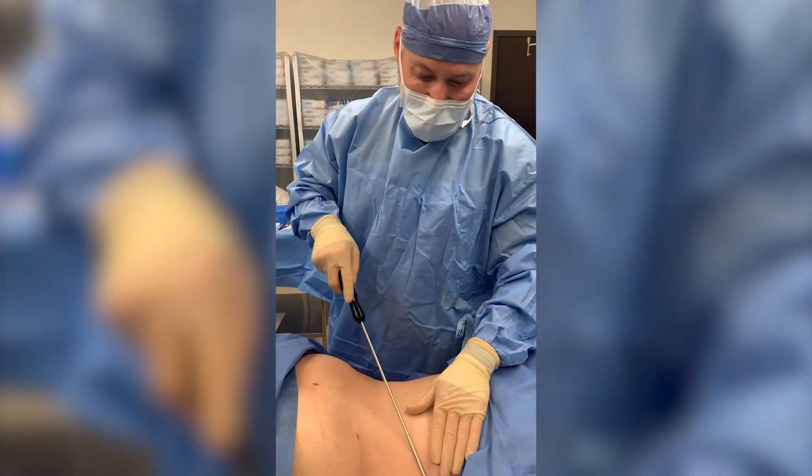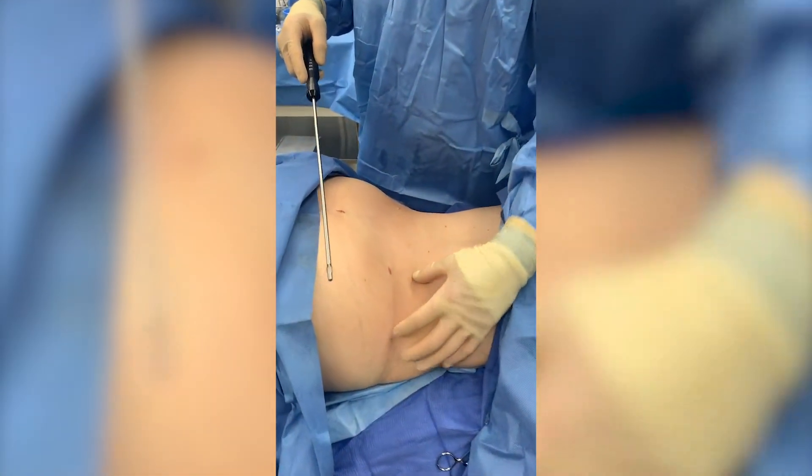Hey guys, here we are. What I've done is I've liposuctioned about 700 cc's from the right flank and from the left flank.